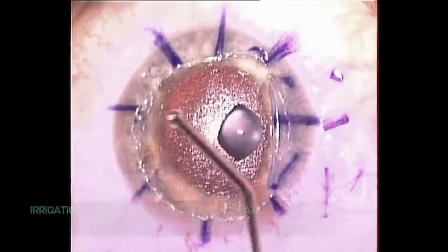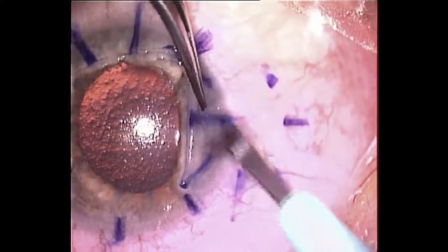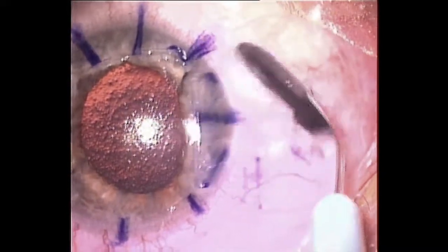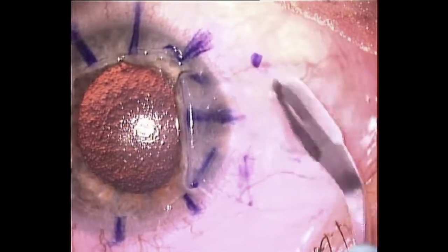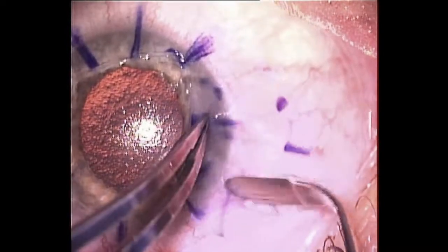Following this, you need to use distilled water, that means deionized water, in order to create an osmotic stress in these cells, making them explode, and also to take away the fibronectin, that is the way in which the ingrowth is created, a kind of pathway to bring the cells into the interface again. Here you see how we are carefully cleaning the stromal surface of the flap as well as we did with the stromal side. Sponges are used in order to eliminate the material.